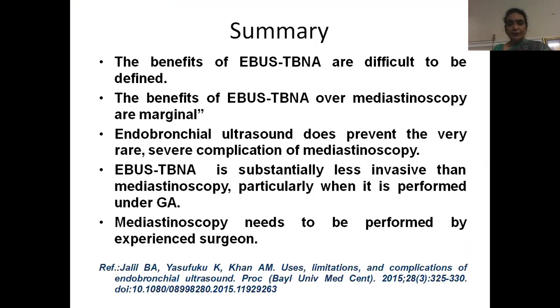To summarize, the benefits of EBUS TBNA are difficult to define. The benefit of EBUS TBNA over mediastinoscopy is marginal. Endobronchial ultrasound does prevent the very rare severe complication of mediastinoscopy. EBUS TBNA is substantially less invasive than mediastinoscopy, particularly when mediastinoscopy is performed under general anesthesia, and mediastinoscopy needs to be performed by experienced surgeons.